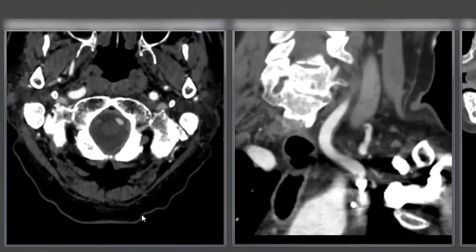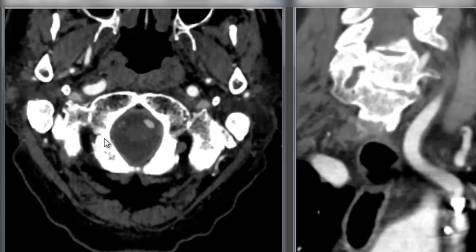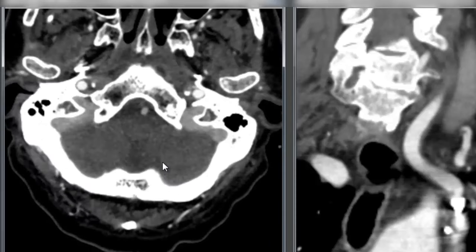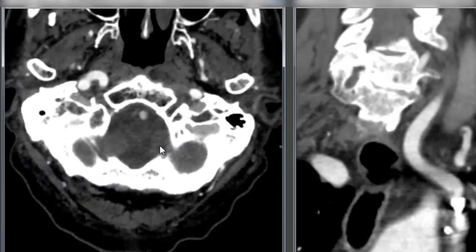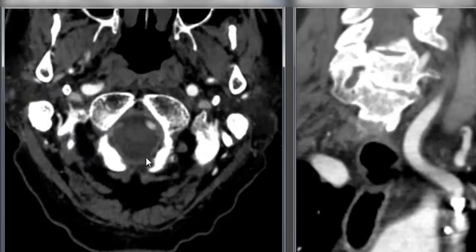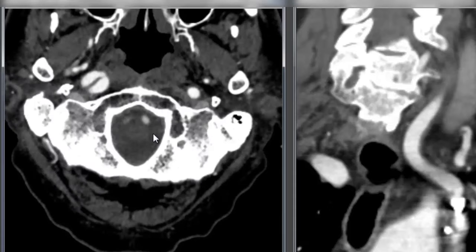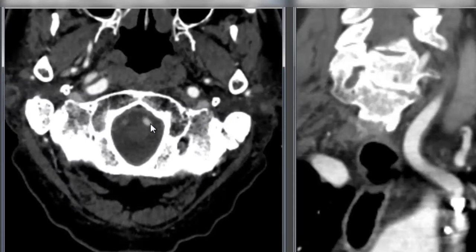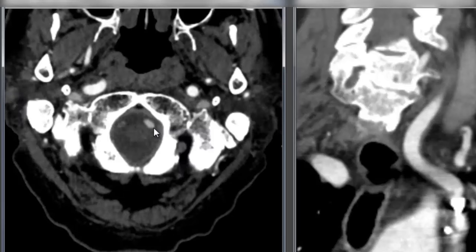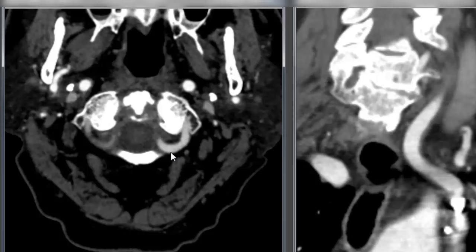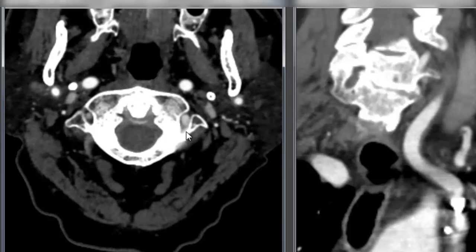Starting with the source images, we're looking here at the skull base. Here we have the foramen magnum and the two vertebral arteries passing intracranially. We have this dominant left vertebral artery as we discussed before, and we're going to follow this down from the skull base.